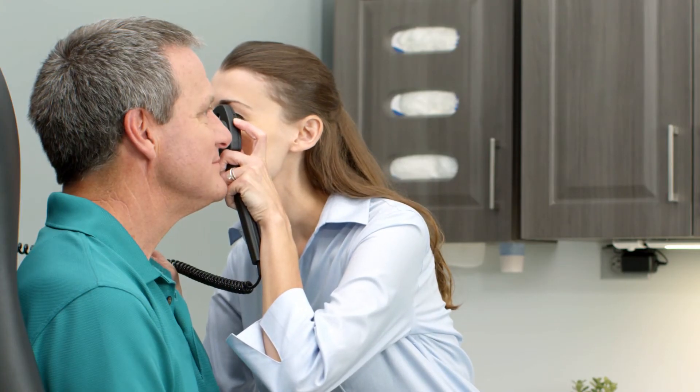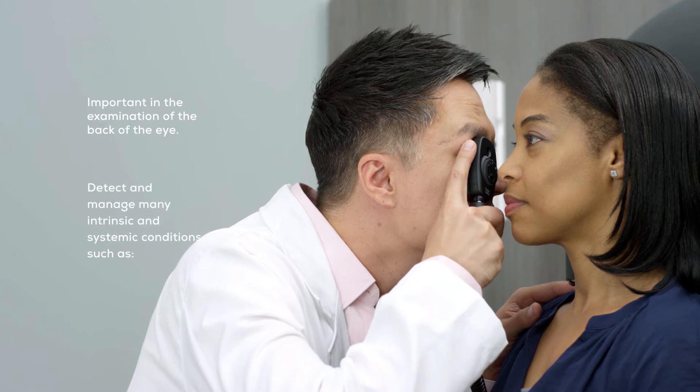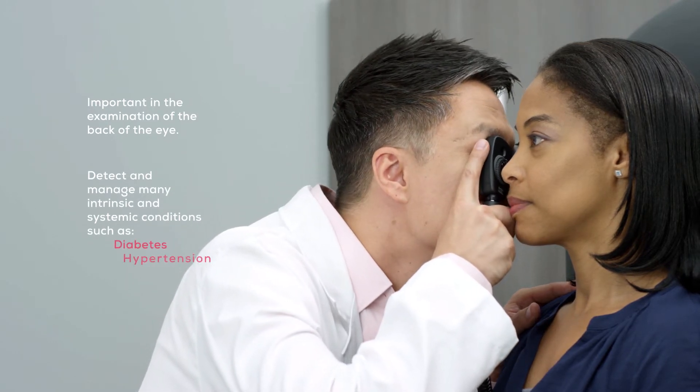Proper physical examination plays a vital role in the diagnosis, treatment, and outcome of a patient's health. The direct ophthalmoscope is important in the examination of the back of the eye to detect and manage many intrinsic and systemic conditions such as diabetes and hypertension.